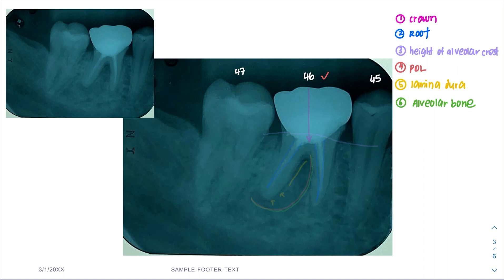The first one, we interpret the crown. For the crown, it is radiopaque from the occlusal until the cervical area, resembling a crown. Next is the root — it shows radiopacity involving both root canals, suggestive of root canal treatment.